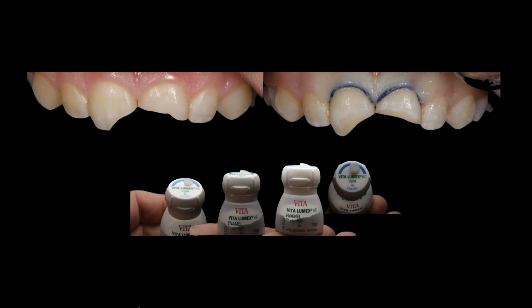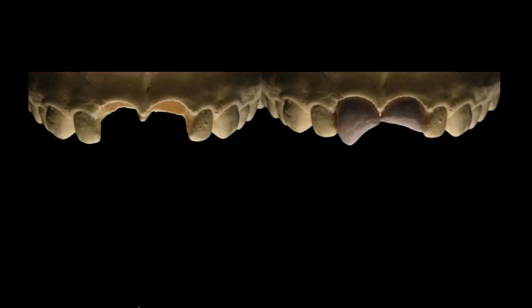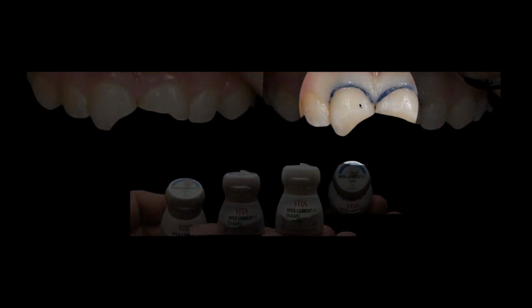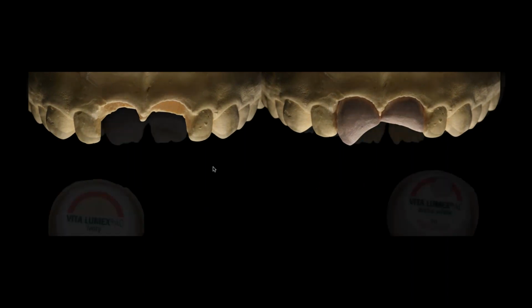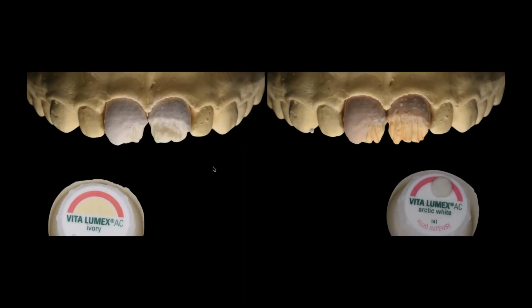So I used my new Lumex AC kit for this. And the beauty of this is actually, you know, it's funny when I see this picture, I'm not sure why the doctor packed cord here. He didn't need to. We're not going to restore anywhere near there. We're only restoring the areas that are missing, but it's kind of funny. So these are going to be treated as refractory dies, and I'm going to lay them as full veneers, micro veneers.